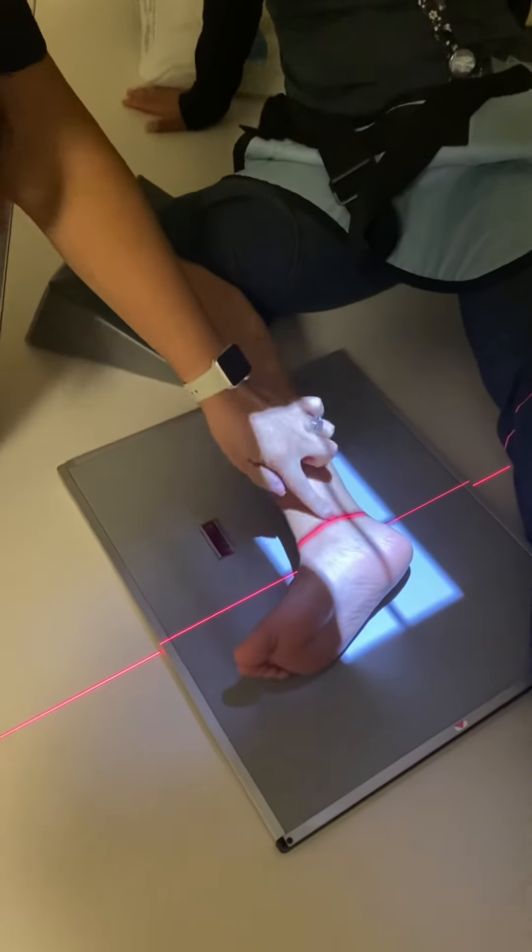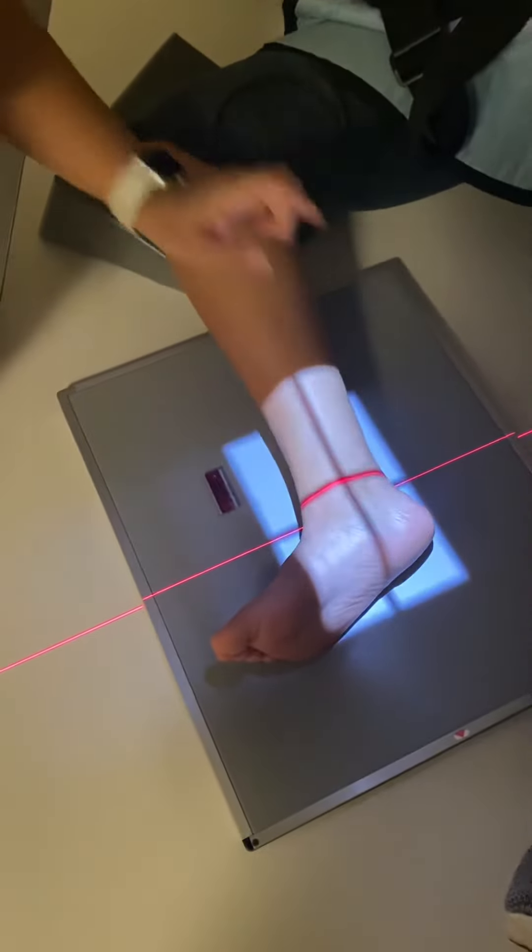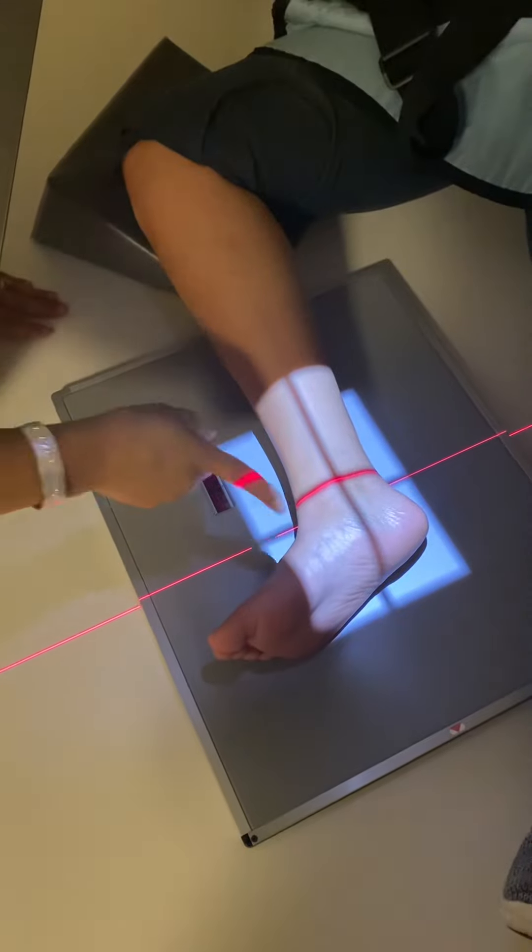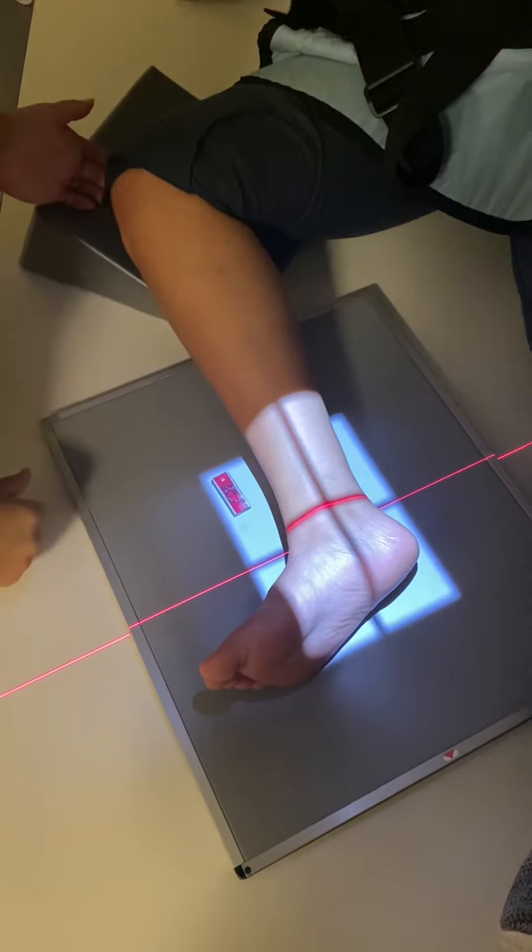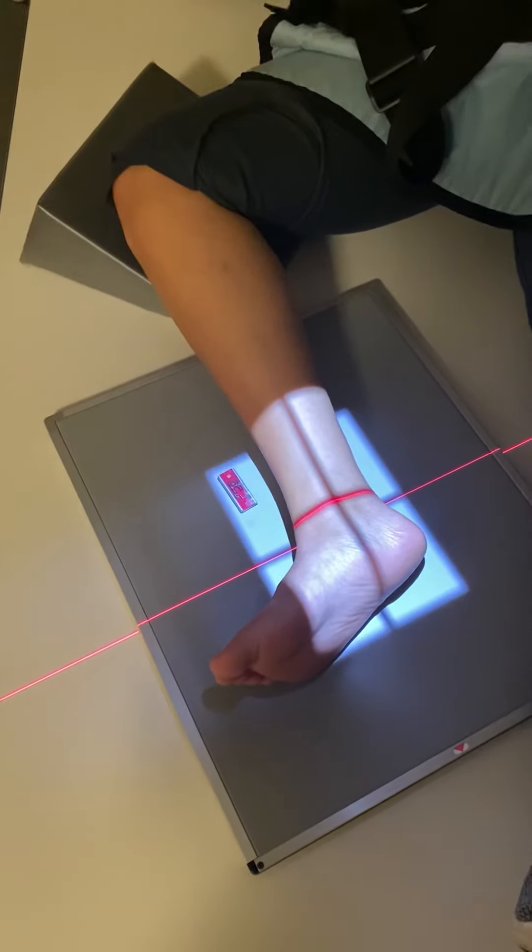I want to center right on the medial malleolus. I want to make sure that I have half of the foot. I get the heel, the plantar surface, and up the leg.